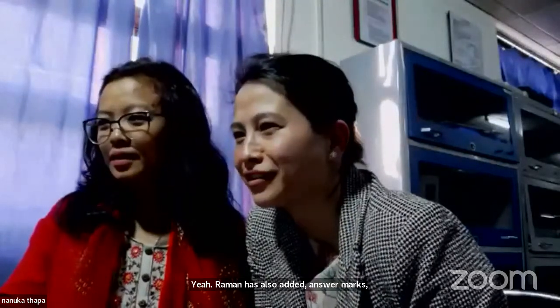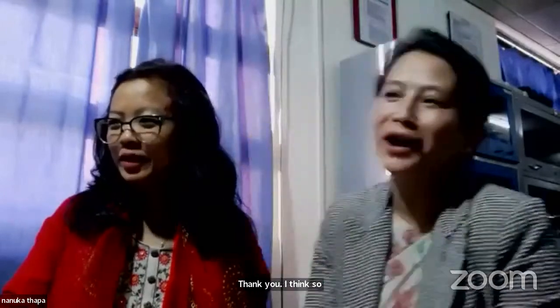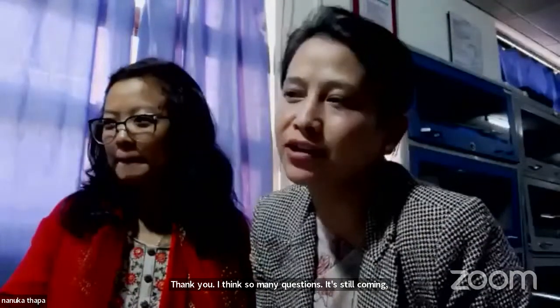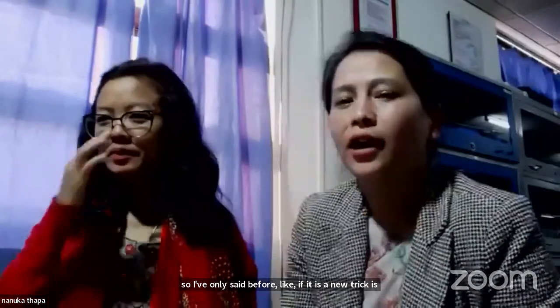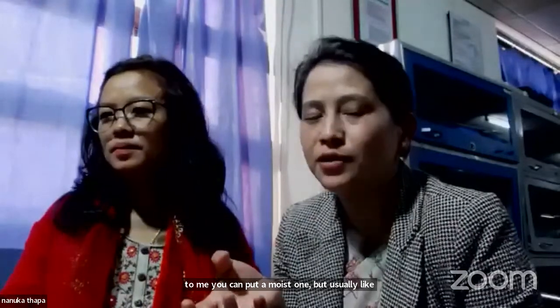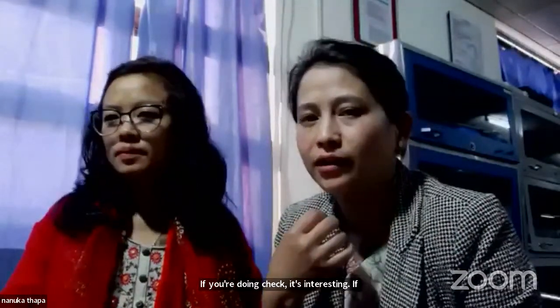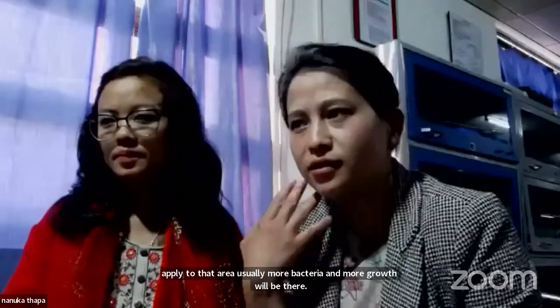Thank you. So many questions are still coming. I've already said that if it is a new tracheostomy, you can put a moist dressing. But usually, if you apply moisture to that area during tracheostomy dressing, more bacteria and more growth will be there. So you prefer dry gauze if you want to cover the tracheostomy.